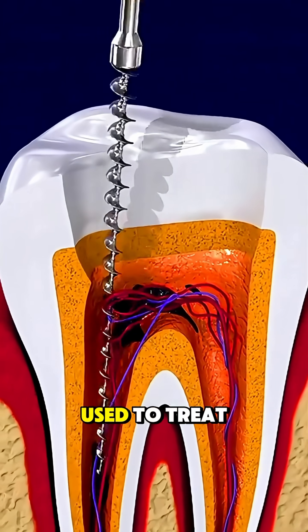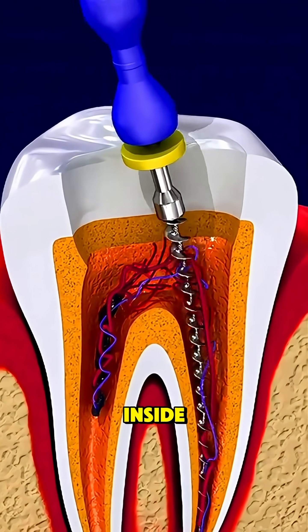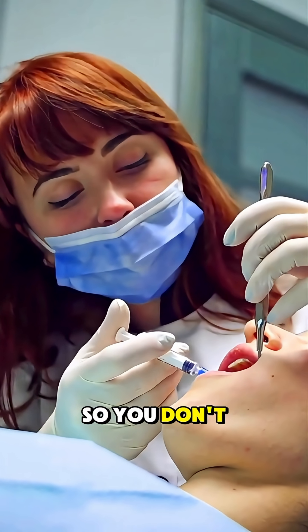A root canal is a dental procedure used to treat a tooth that's badly decayed or infected deep inside. It starts with numbing the area around the tooth so you don't feel pain.